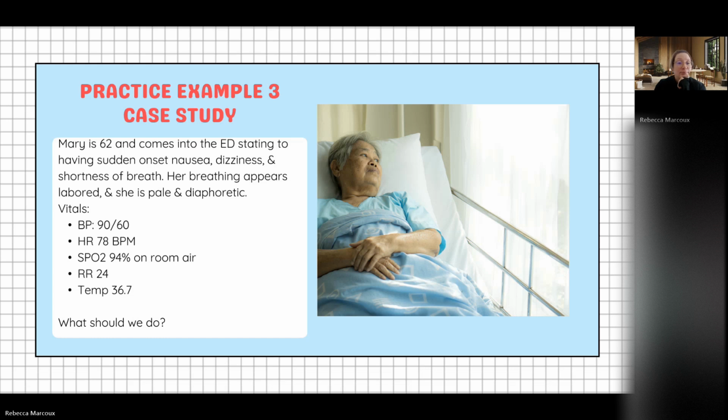Is the question asking what information we need to get, like asking the patient if they have chest pain, or because the blood pressure is low, that can be something you can do? Absolutely. You can ask the patient if they have chest pain, or assess patient LOC.